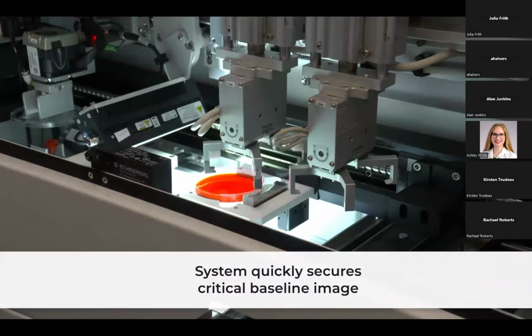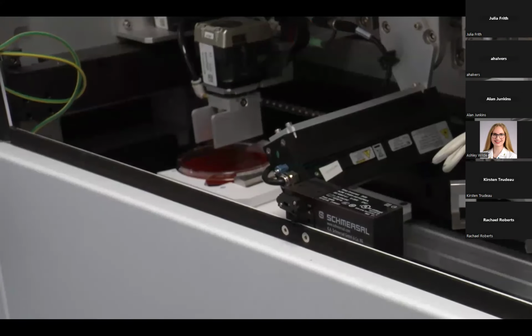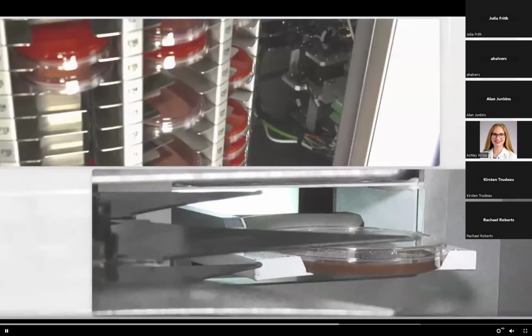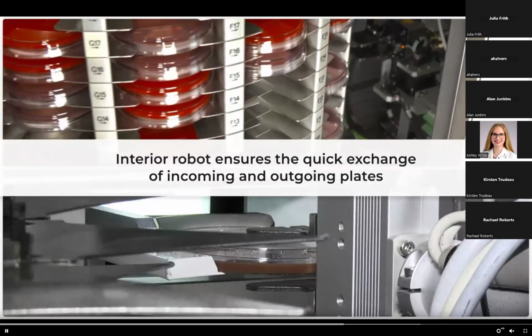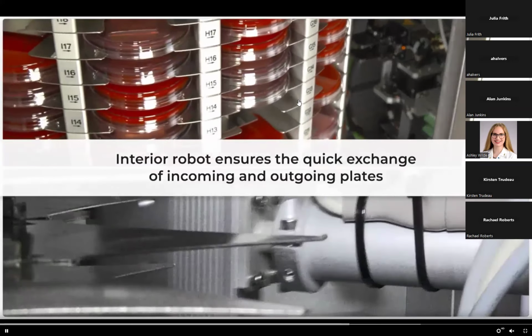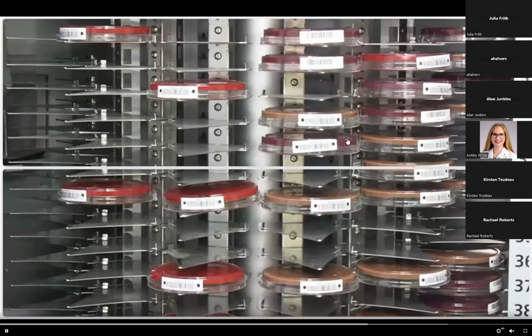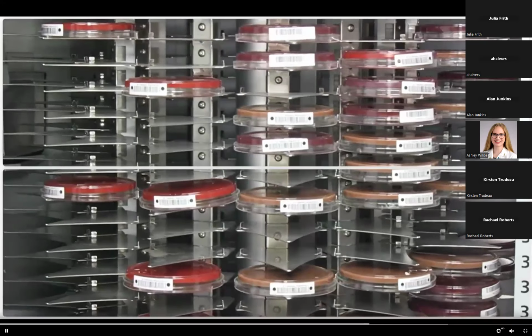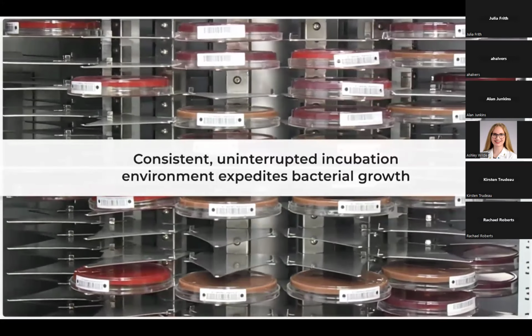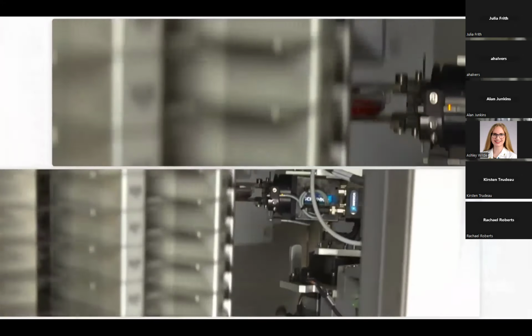When we did it manually, we could tell if there was something wrong with the plate. But since we're not doing this manual anymore, we don't see that. Goes through that little bitty slot into the incubator, which holds a whole lot of plates. It'll flip it over and it'll slide it into one of these slots here. Okay, so it's going to incubate there. And like I said, at a certain amount of time, it will pull that plate out, it will re-image it, and then it will show up on our computer screens, and we can do the workup or whatever we need from that point.